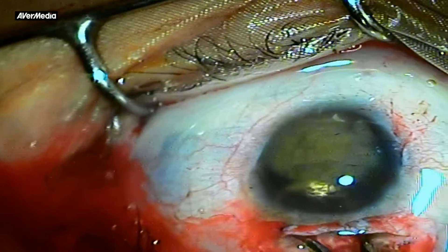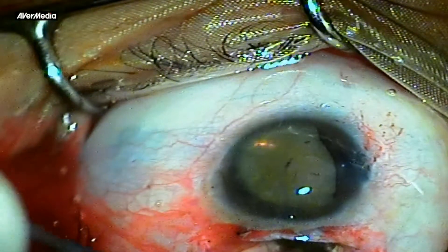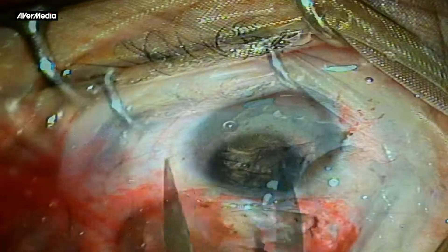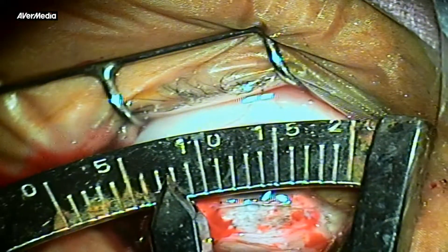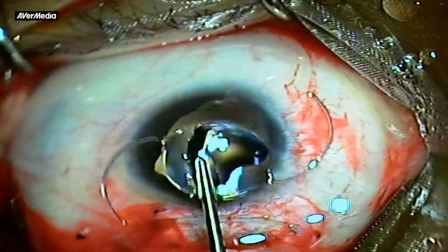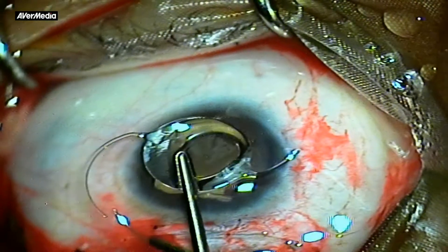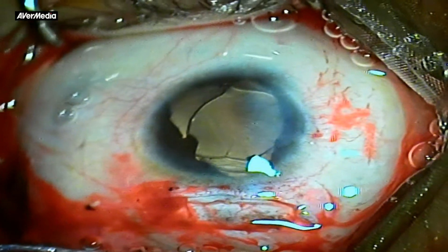Again, in a bold move, the irrigating vectus was introduced behind the nucleus inside the capsular bag. The nucleus was delivered by pulling it out of its bag. Notice here that the inferior zonules were missing but the bag was stable. The cornea measured less than 8 mm wide and the nucleus measured just over 6 mm. Again, the IOL haptics were suitably trimmed to achieve a comfortable in-bag fixation. In this way, tackling a case of microphthalmia with coloboma with dense nuclear cataract requires special skills and modifications in surgical technique to achieve a desirable outcome.